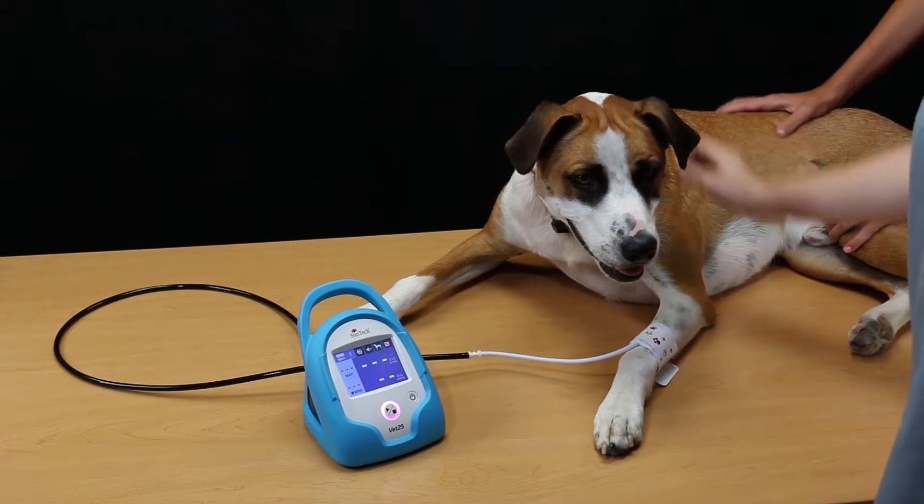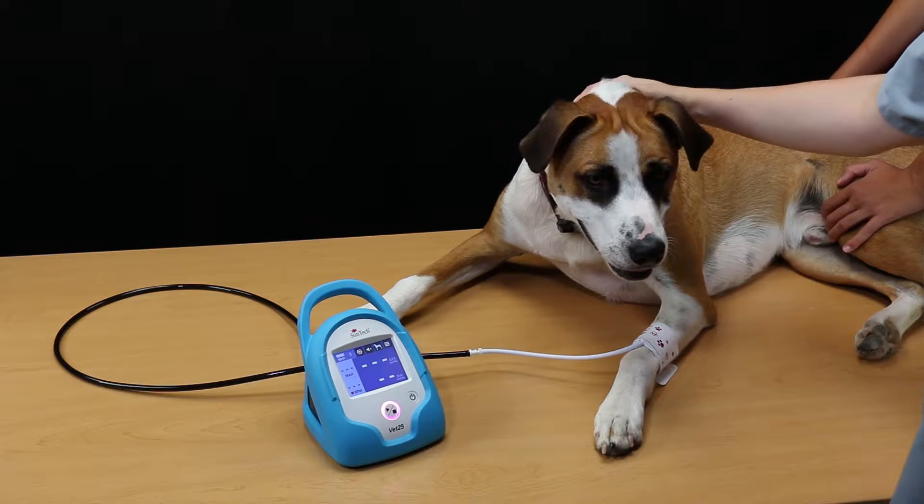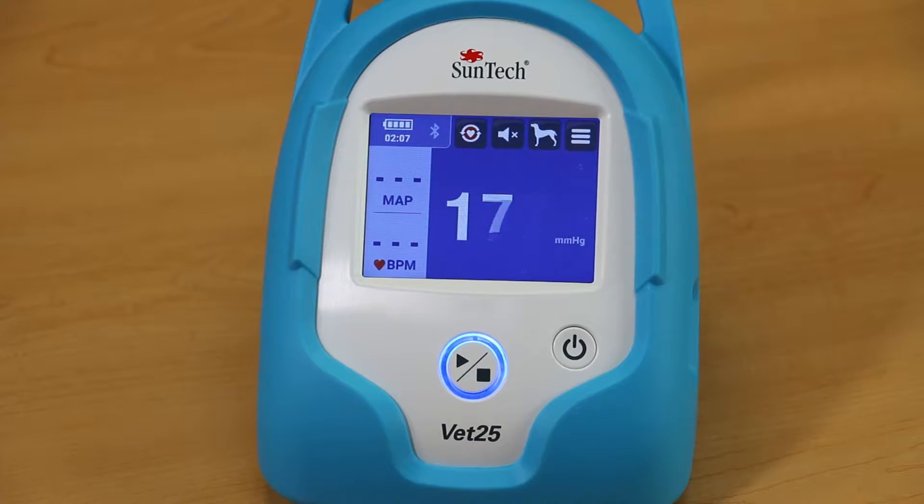For the most accurate BP measurement, ensure that the cuff is snug on the patient's limb or base of the tail and that the cuff is at heart level. To take a single BP measurement, press the Start button.